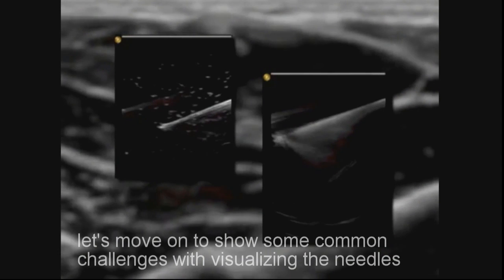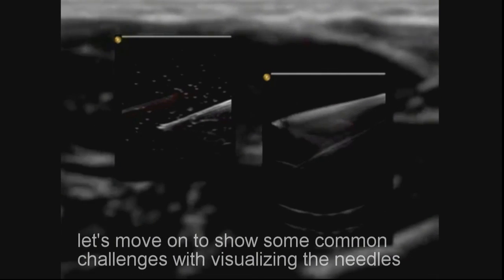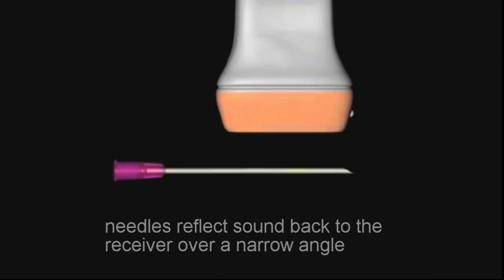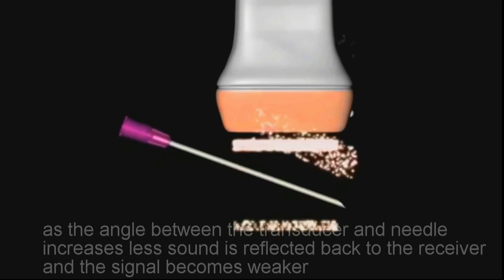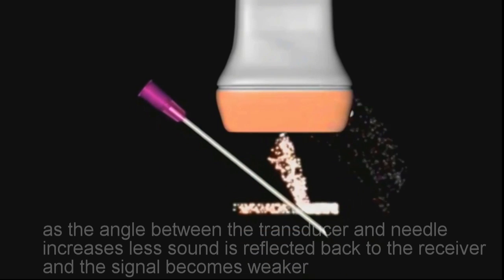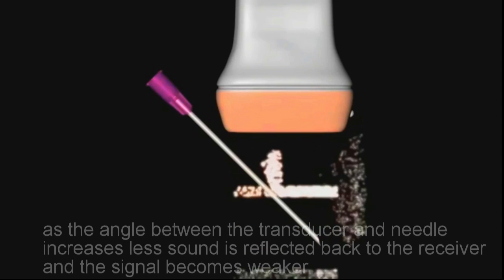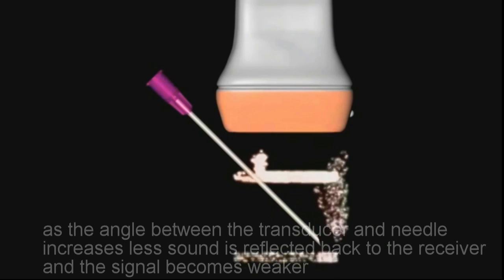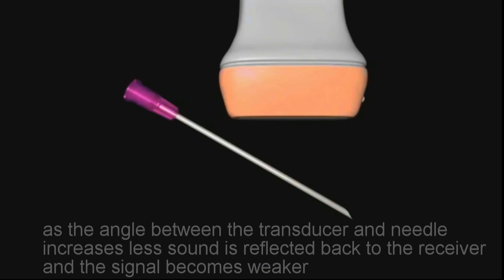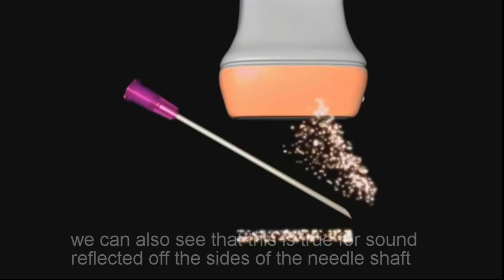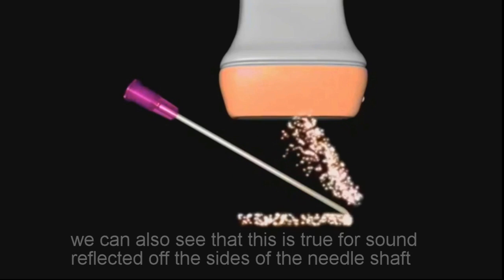Let's move on to show some common challenges with visualizing the needles. Needles reflect sound back to the receiver over a narrow angle. As the angle between the transducer and needle increases, less sound is reflected back to the receiver and the signal becomes weaker. We can also see that this is true for sound reflected off the sides of the needle shaft.